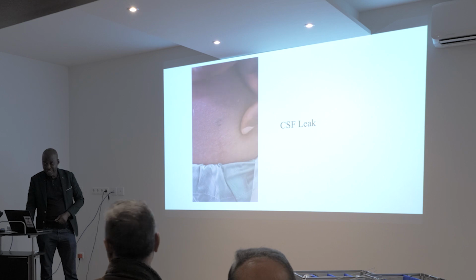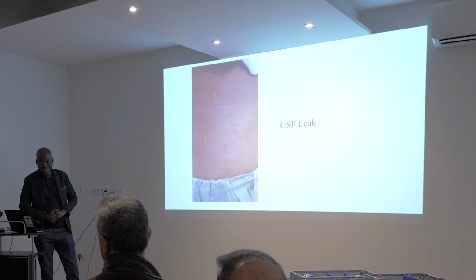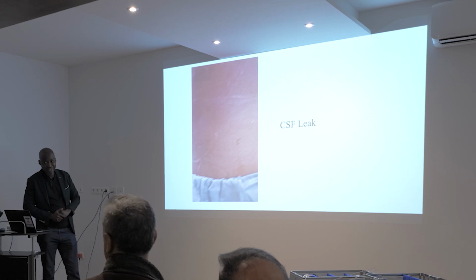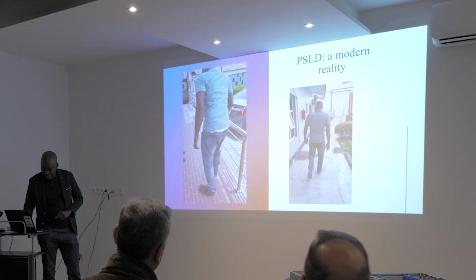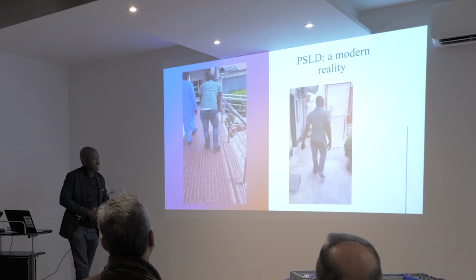That's how. Also the good advantage for transforaminal surgery is that the path the liquor has to go through to come to the skin is much longer. Yeah, then. So I also never had CSF leak in endoscopic surgery transforaminally. So that's it. And this is a reality. PSLD is a modern reality.